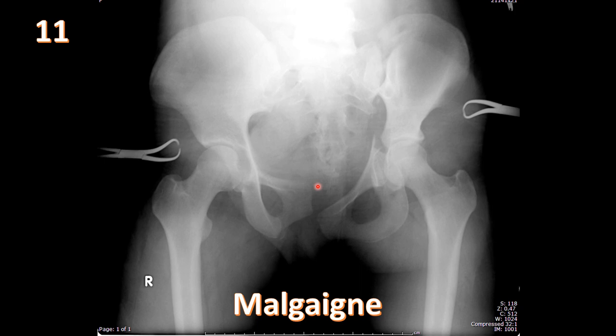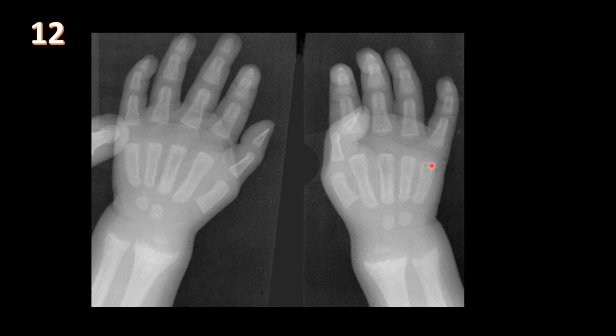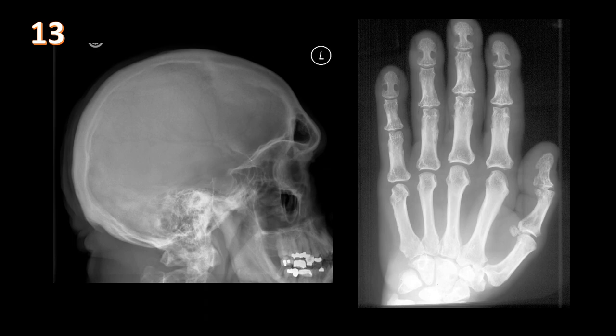Two views of the hand in a pediatric patient show mild osteopenia with cupping and irregularity of the distal metaphyses of the radius and ulna — very characteristic of rickets, related to vitamin D deficiency. In children, it affects the growth plate and metaphysis. In adults it is called osteomalacia, related to abnormal bone mineralization. Whenever you see fraying, cupping, and irregularity of the metaphyses in long bones, think rickets.